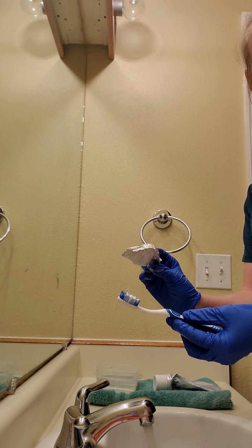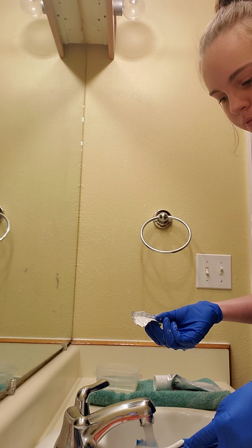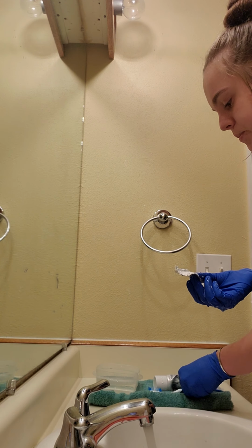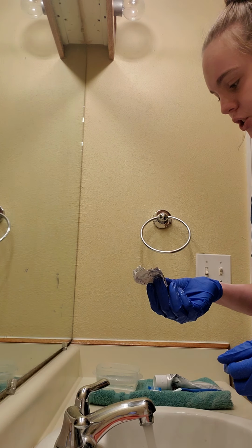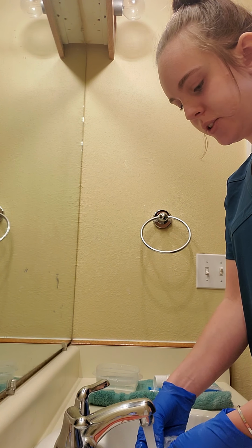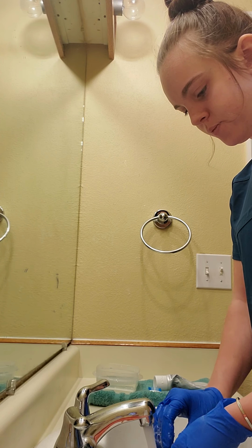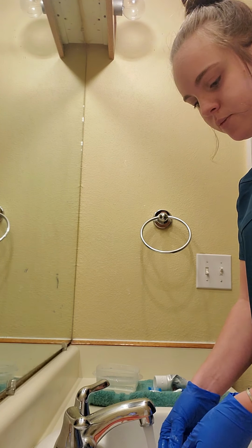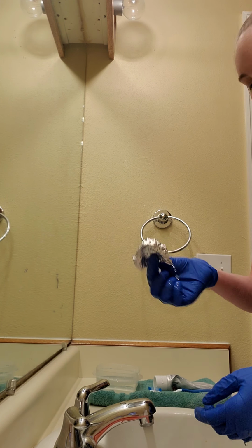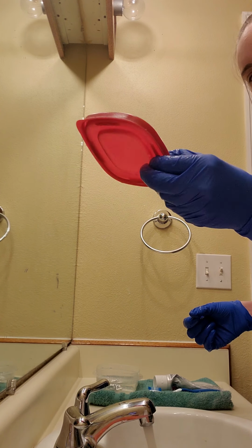All right, now that I've cleaned all of that, I would first rinse the toothbrush and set that aside. I would then take the dentures and rinse those to make sure that there is absolutely no toothpaste. I would then put these back into the cup and close it with the lid.